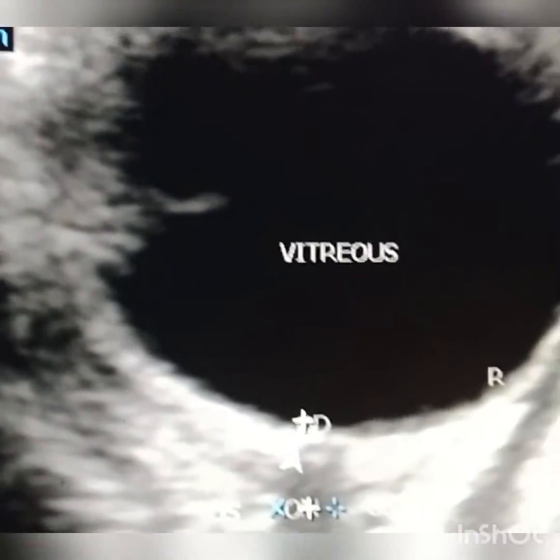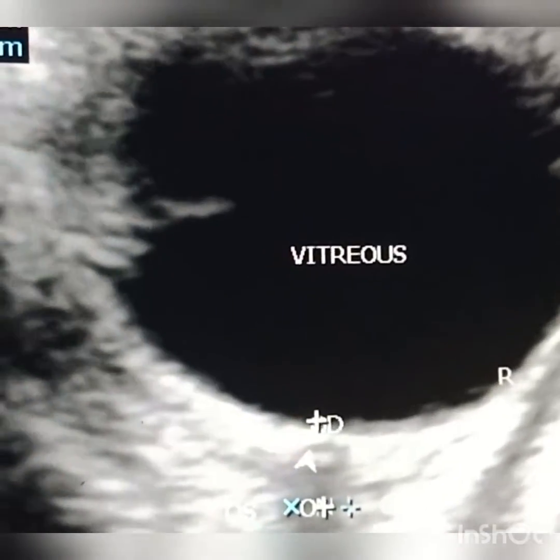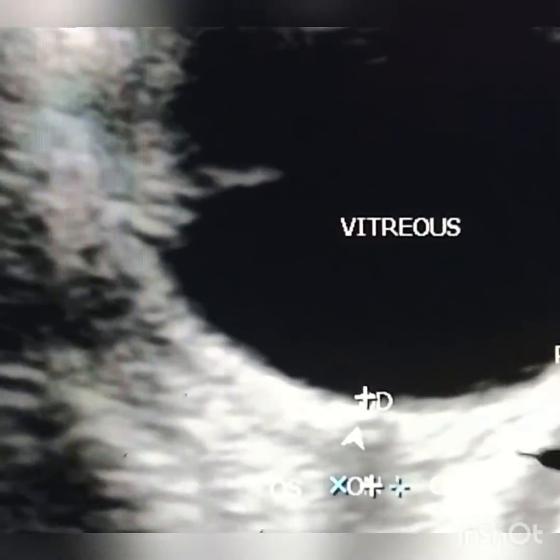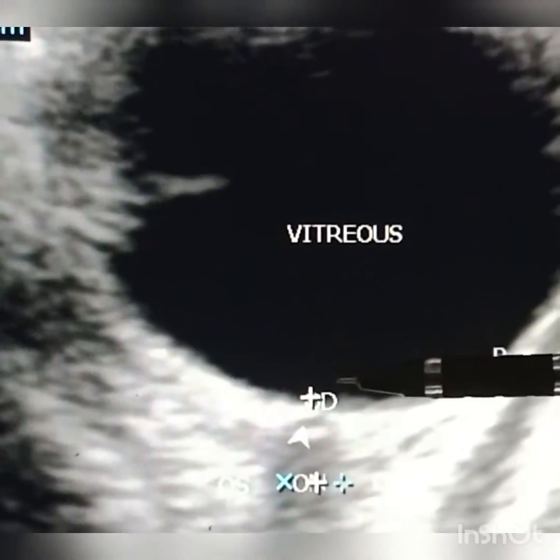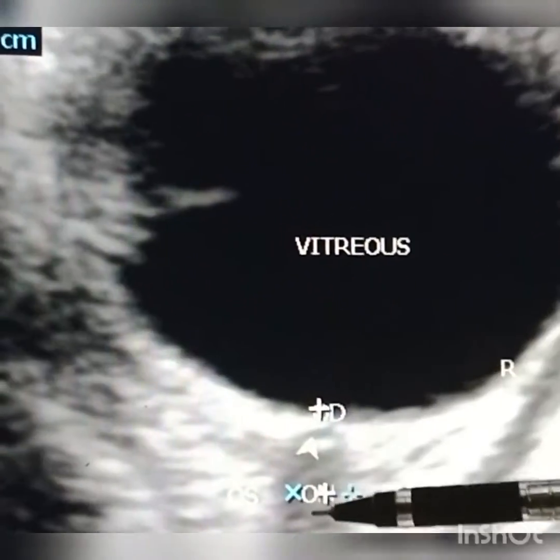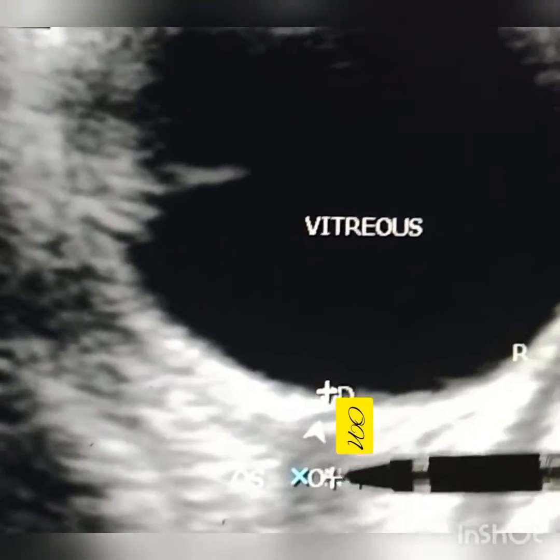What you see is the black area is the vitreous, then the retina, then the optic disc. And from the optic disc what you see are two important areas: a hypoechoic area and a hyperechoic area.